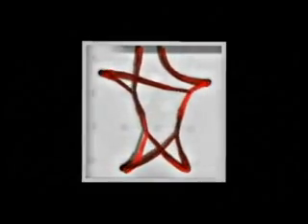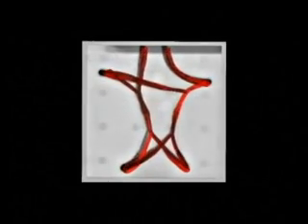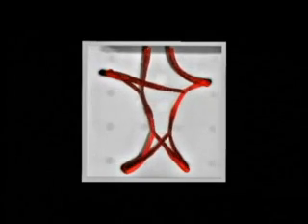Rotational X-ray fluoroscopy is a new technology that allows for a number of new ways to see structures in the heart. One of those is 3D vessel modeling, in which the contrast images of the coronary vessels are used to generate a three-dimensional model that the physician can look at from any orientation without having to continue exposing the patient to more X-rays and contrast agent.